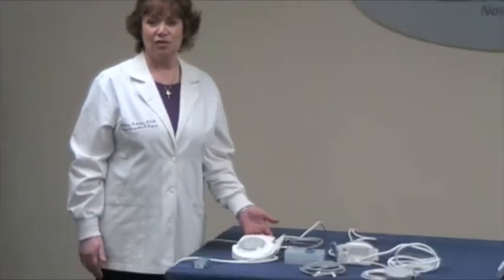Hi, I'm Colleen Rutledge, Registered Dental Hygienist, and I'm here today to talk about the Neutron line of ultrasonics from Satellac, the equipment division of Actaeon. I want to first start out by talking about our entry-level piezoelectric scaler, which is the P5 Neutron.